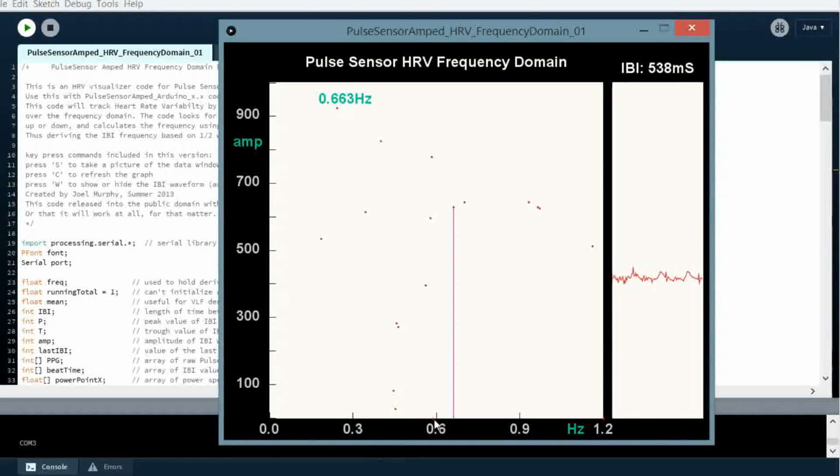I don't know if you notice this little one down here off the window. If I hold on long enough, it's going to start printing dots probably all over the place. Oh, see, we got one over here in this window now. Got some up here. So, I mean, it works, but it's not that well behaved.